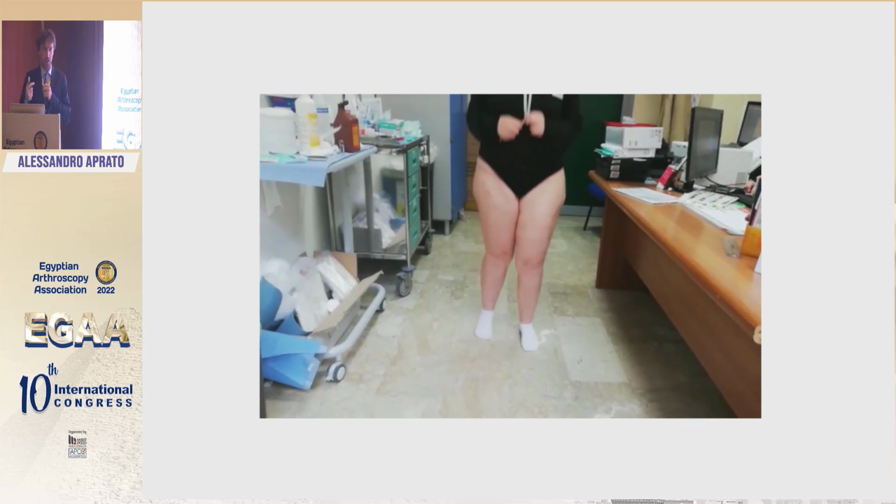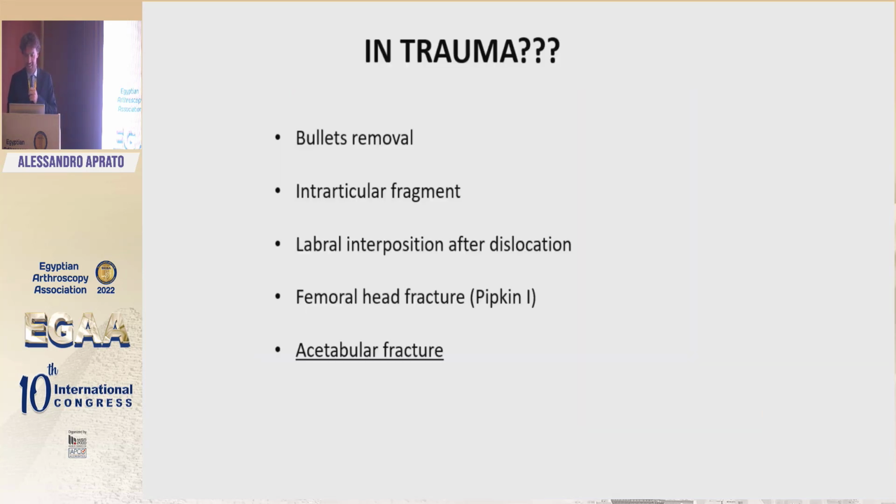I struggled a lot, but now she can do that. So I was very happy with this. Then the other indication, the other side of the moon, is the acetabular fracture. On the acetabular fracture, can we do something arthroscopically?